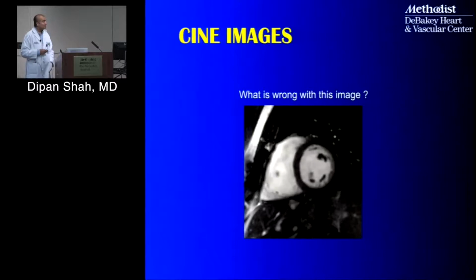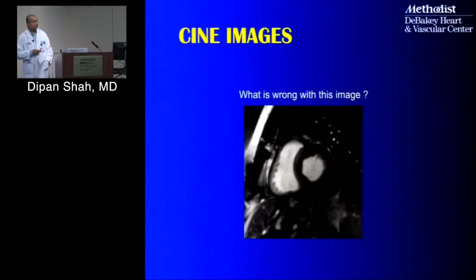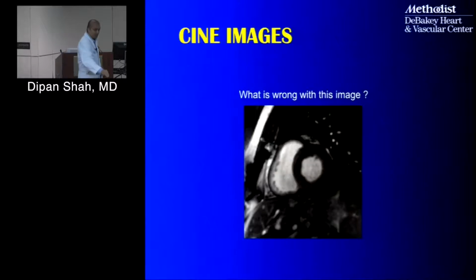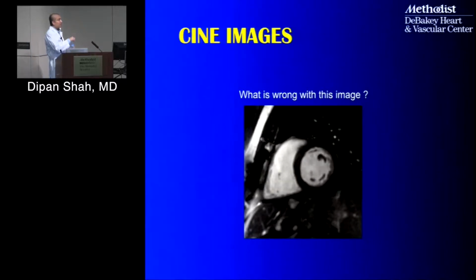Now, what about this image here? So how does this look? So do you see systolic contraction nice and smooth?